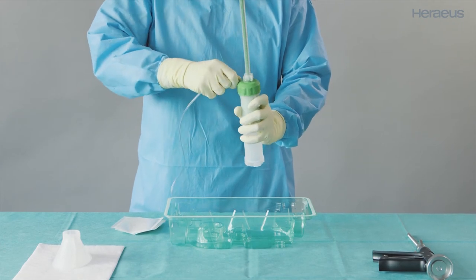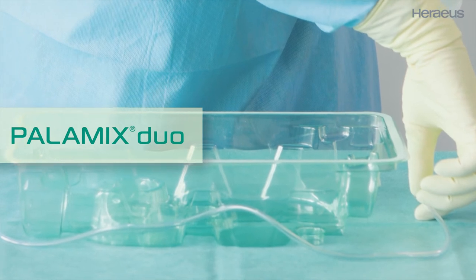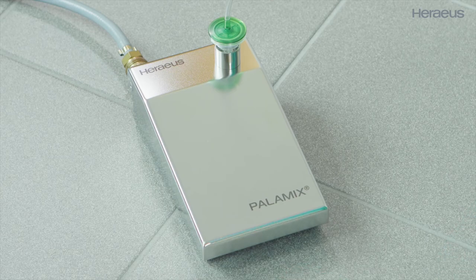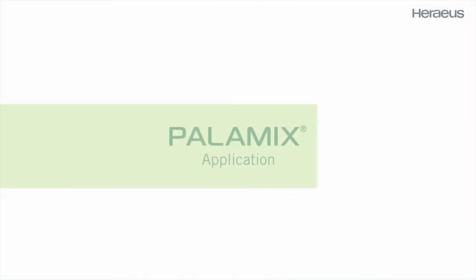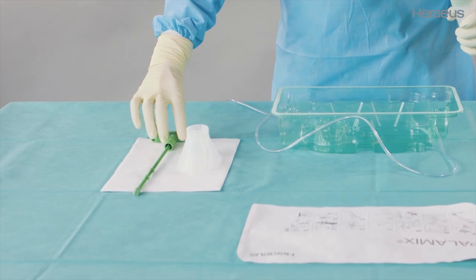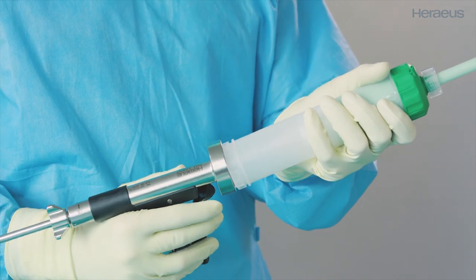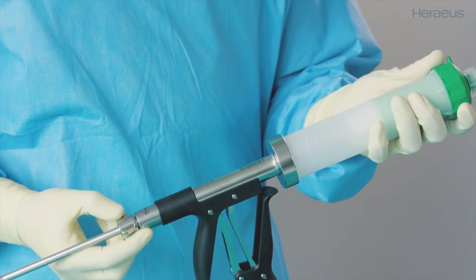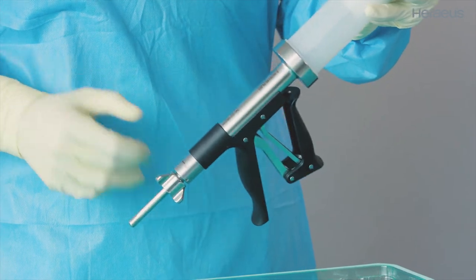Remove the vacuum hose. When using Palomix Duo, set aside the vacuum hose in the sterile area. Release the vacuum pump foot switch, then release the handle and retract the mixing rod. Set the mixing rod aside in the sterile area. Screw the cartridge onto the Palomix cement gun with a quick rotational movement until a click is heard. Release the locking mechanism and push the feed rod into the cartridge as far as possible, then re-engage the locking mechanism.